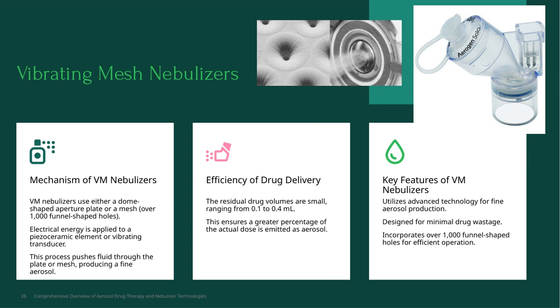Focusing on vibrating mesh nebulizers specifically, they incorporate advanced technology to produce very fine aerosols consistently. They're designed to minimize drug wastage, which is especially important for costly medications. Their mesh contains over 1,000 funnel-shaped holes, which ensures efficient and uniform aerosol generation. Overall, these features make VM nebulizers a highly effective and efficient choice for aerosol drug therapy, aligning perfectly with our goal of optimizing drug delivery while minimizing waste.